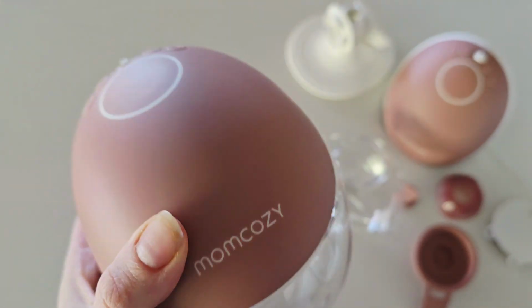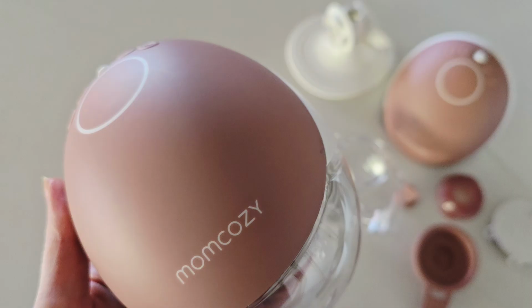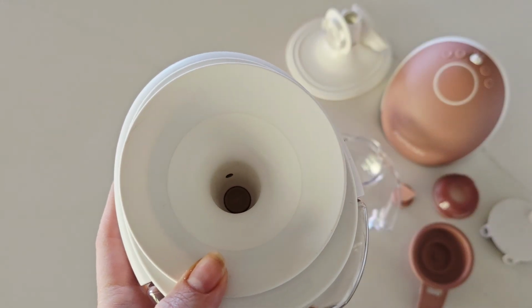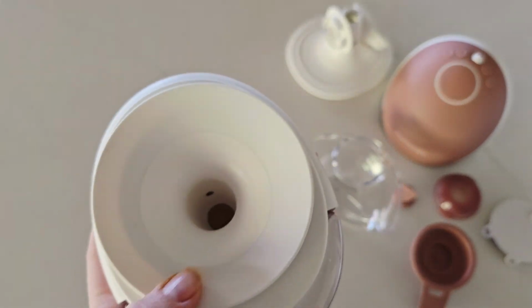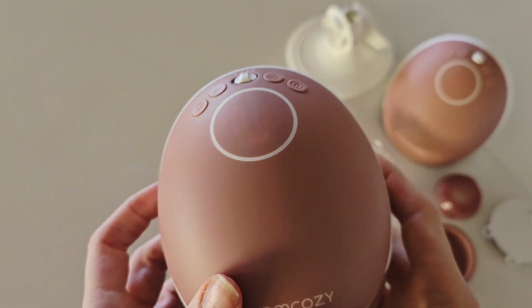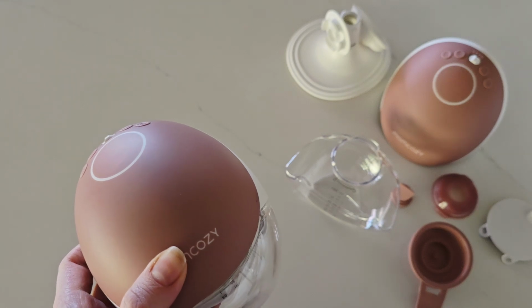Your pump might even start sounding a lot noisier than what it normally was. That's, again, an indication that your parts are wearing and that they may need to be replaced. And then you might find too that your flange is just feeling a bit more uncomfortable than what it has been, which could be a sign that your flange has loosened a little bit or your flange inserts have stretched and it is time to replace them. So let's dive in and take a closer look at which pump parts you should replace and how often.